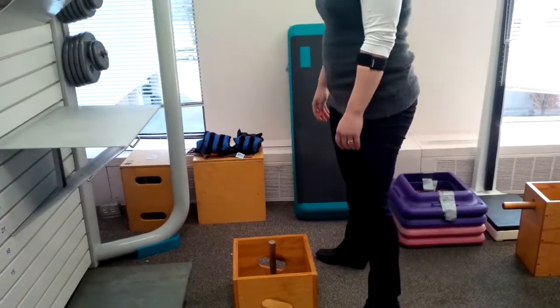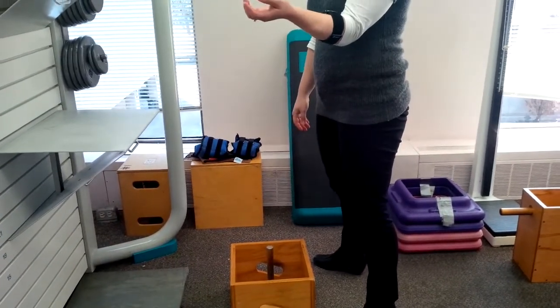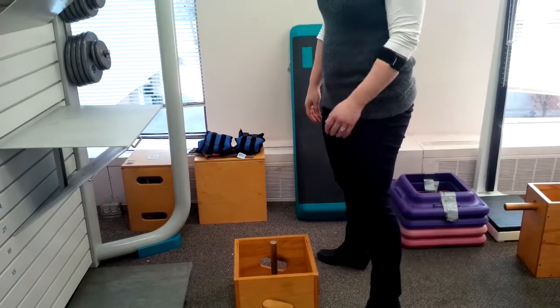Ready to go. We're going to take the person's heart rate first. 104. 104, okay, great.